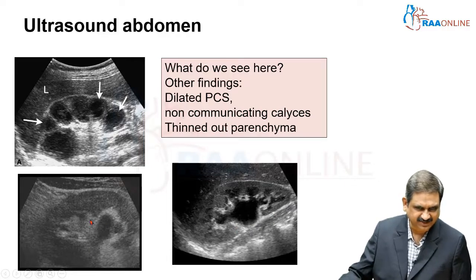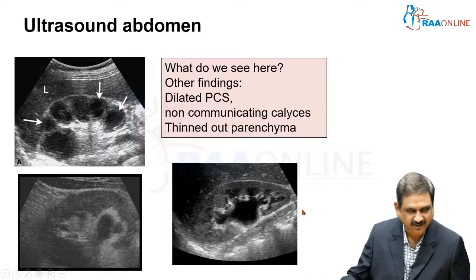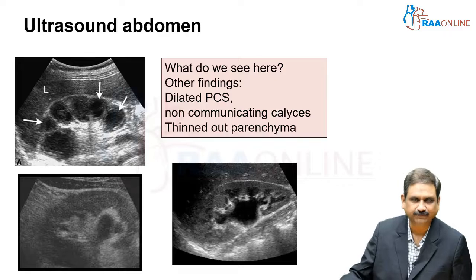The third presentation is you have an isolated renal pelvis, where the calyces are not dilated and the cortical thickness is very well preserved, and these patients have a centrally located dilated renal pelvis, but not much of a dilatation. So the patients can present in any form depending on the site of obstruction, site of involvement and the degree of obstruction or extent of involvement. So these are all the factors which will decide the type of image that you get in your ultrasound.